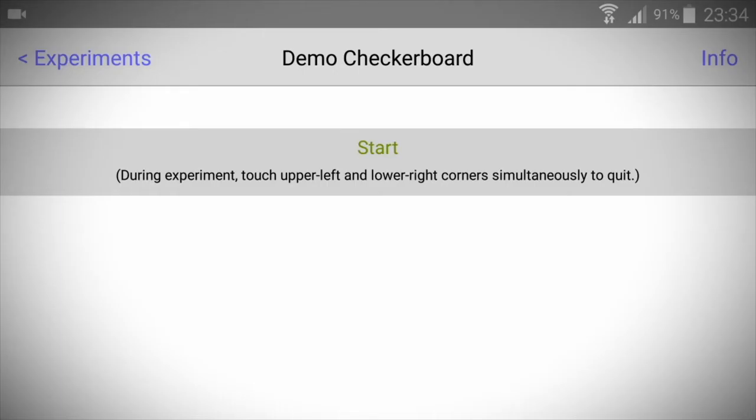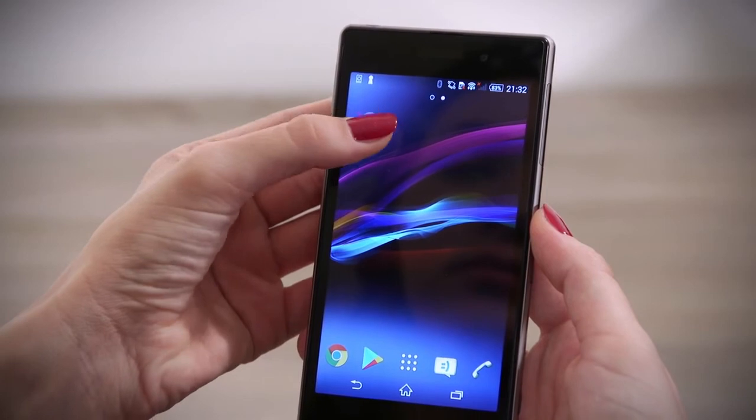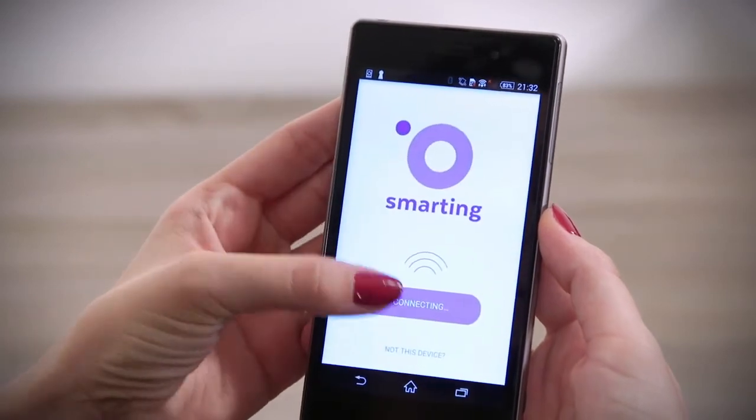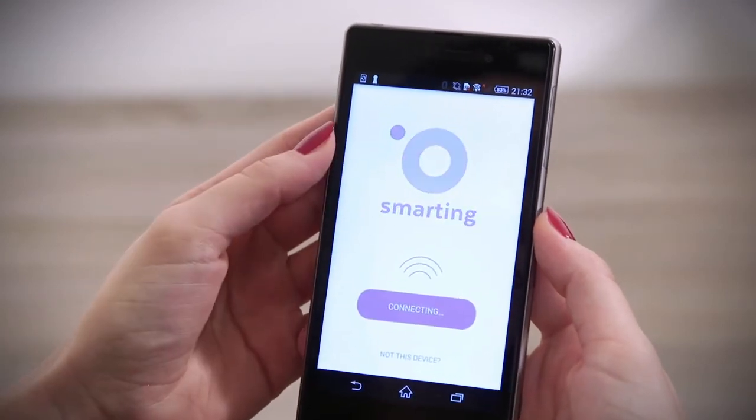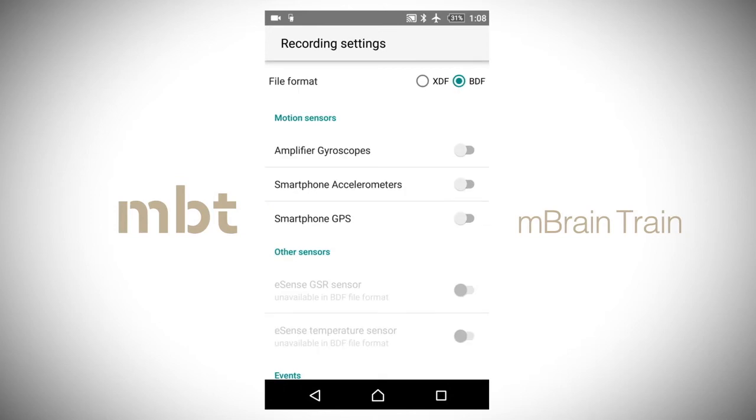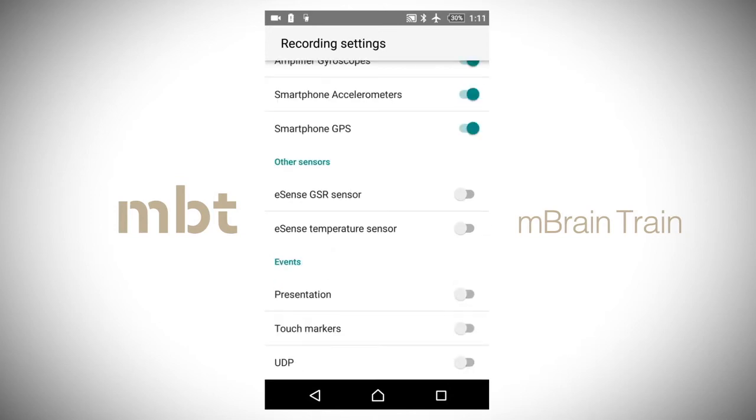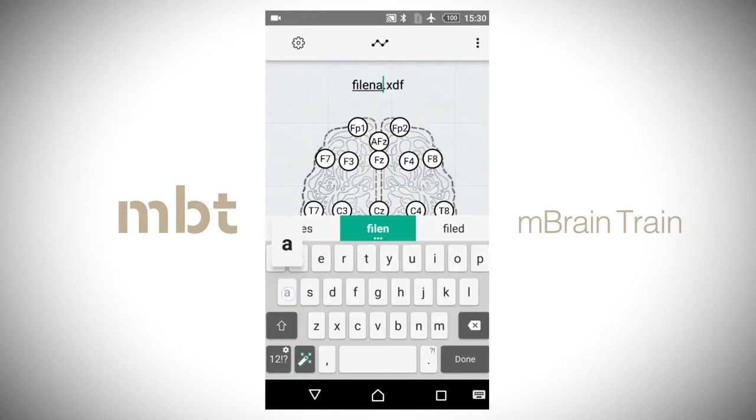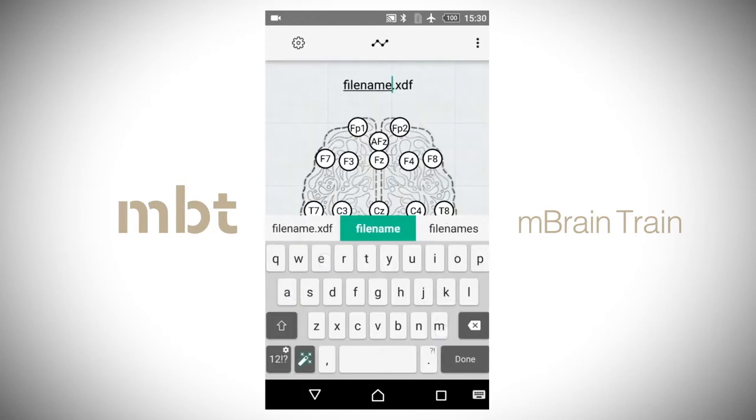Open the Smarting app and connect to the Smarting EEG system. Go to settings and enter the recording settings. Select the XDF file format and enable presentation from the events menu. Go back to the main menu and provide the desired file name.